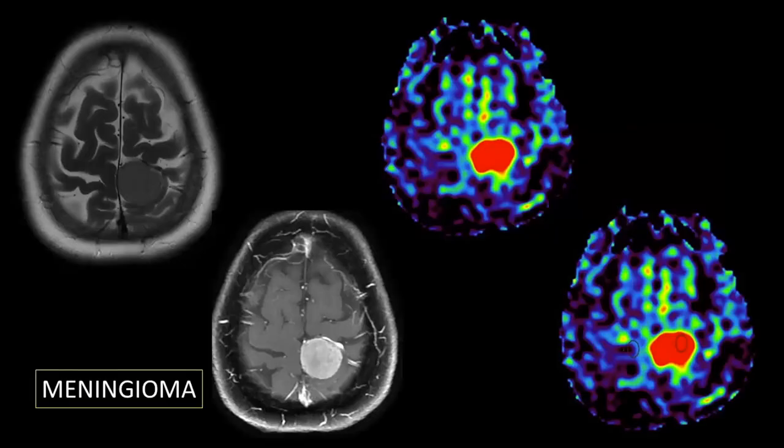Not only for intraaxial lesions, ASL can also depict hyperperfusion in something like meningioma. So even without giving contrast, you can confidently diagnose meningioma with this kind of ASL picture.